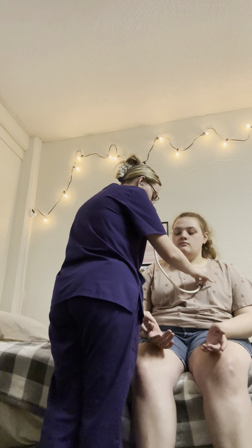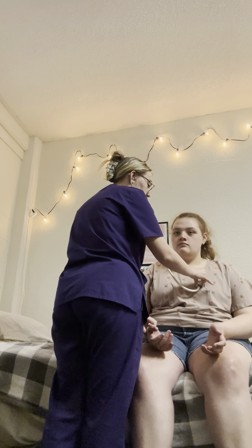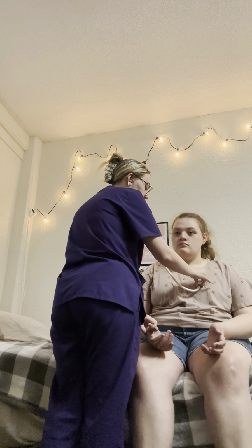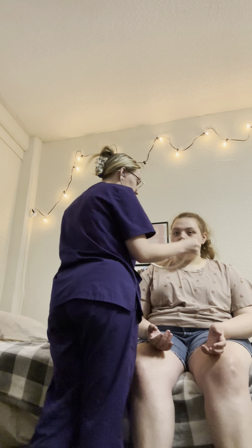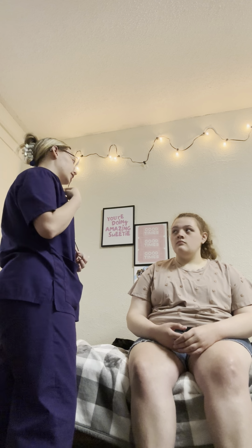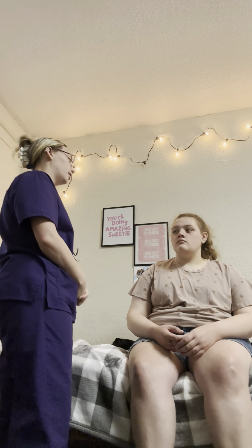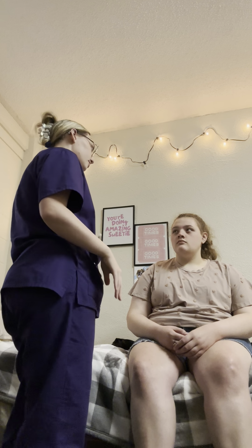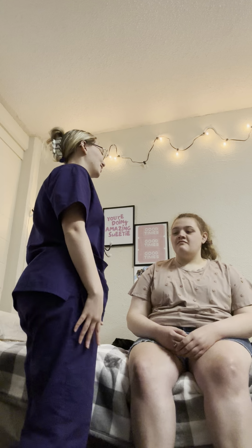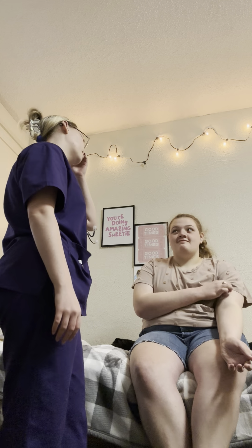And then I'm actually going to go ahead and check the radial pulse at the same time. We're going to see if there's a pulse deficit. We usually do this for 1 minute, but it might be a little shorter for the video. Alright. I usually listen to this for 1 full minute. We're not going to do it today. There was actually a less than 1 second, but a little bit of a lag between your apical pulse and your radial pulse, but that's fine. I know that you're also a little nervous, so it's okay. But everything else, I could hear her heart sounds. I didn't hear any abnormal heart sounds by any chance.